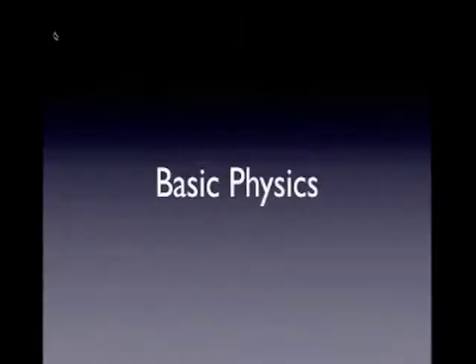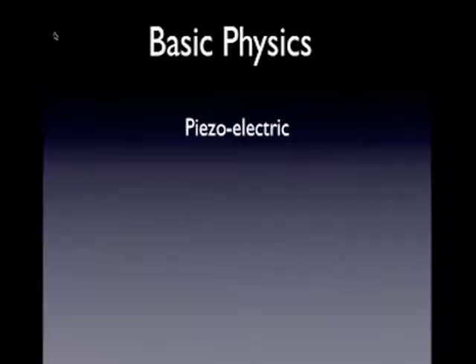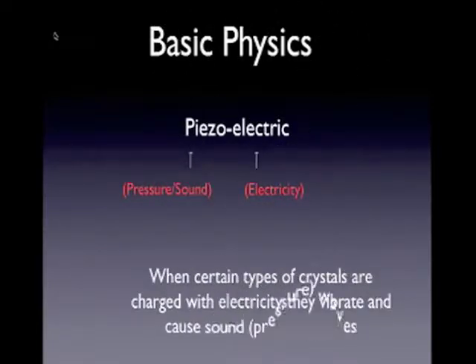Now let's discuss some basic physics to help you understand more about emergency ultrasound. Ultrasound uses piezoelectric crystals that convert electrical energy to mechanical energy through sound waves, which are projected into the body. When the sound waves return to the probe, they are converted back into electrical energy.